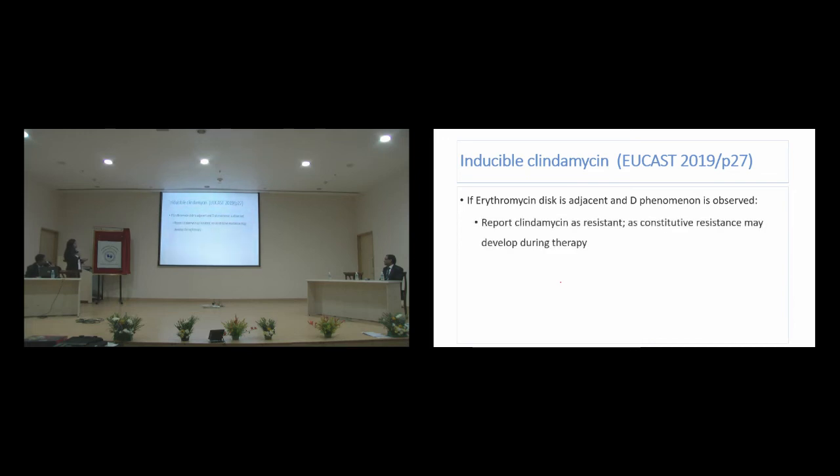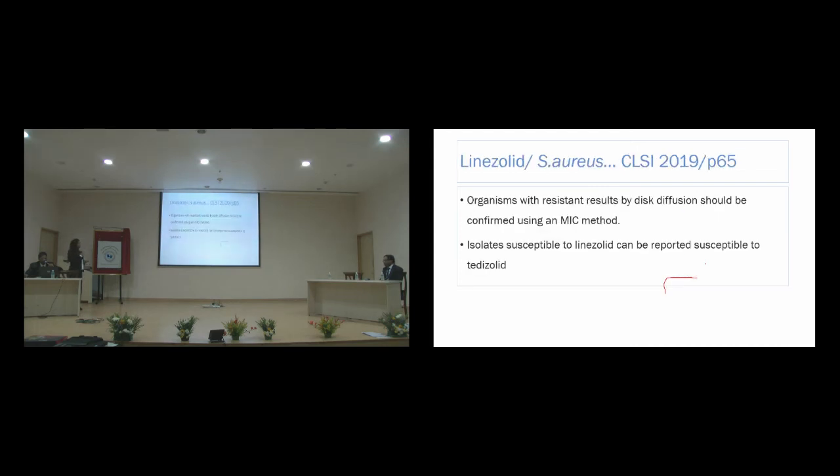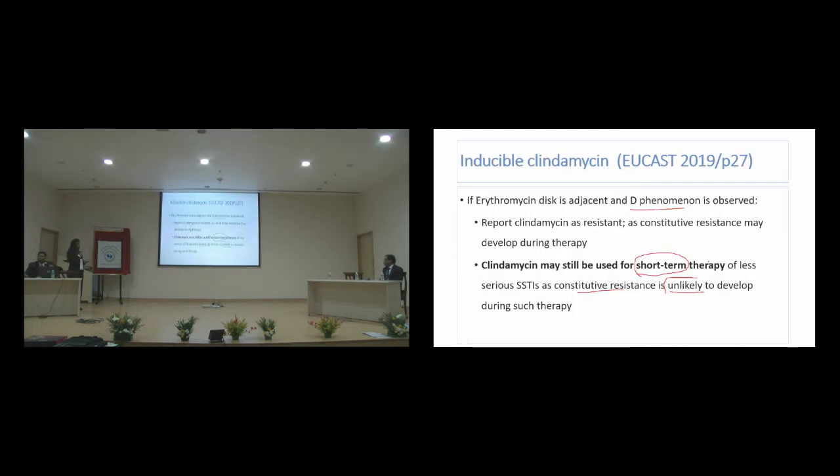Next, a brief note on inducible clindamycin resistance. If an erythromycin disk is adjacent to the clindamycin, we see something called the D phenomenon, which is depicted here. Report clindamycin as resistant because constitutive resistance may develop during the therapy. But there is also a note that clindamycin can still be used for short-term therapy because constitutive resistance is very unlikely to develop. This is about inducible clindamycin resistance.